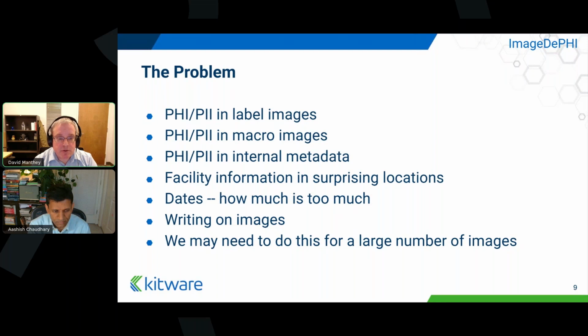You have a pathologist who's written the word Gleason and a score on a slide, and hey, we all as researchers know that's a Gleason score and not the name of a patient, or that's the likely way to imagine it. But if it has some other word, you have to actually make a judgment call and say, is this PHI, or is this just a word that the researcher who was doing this has included?